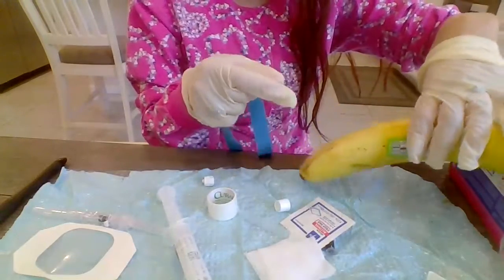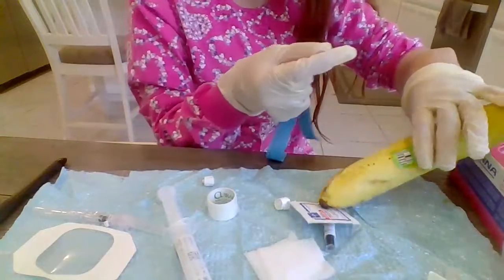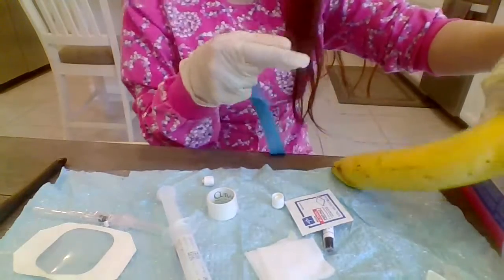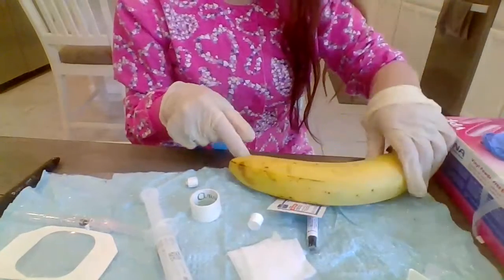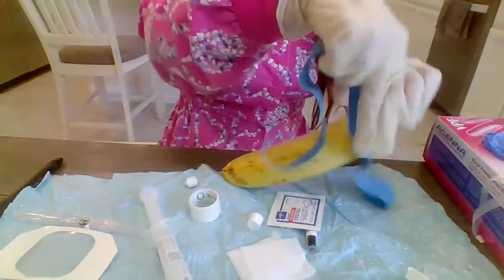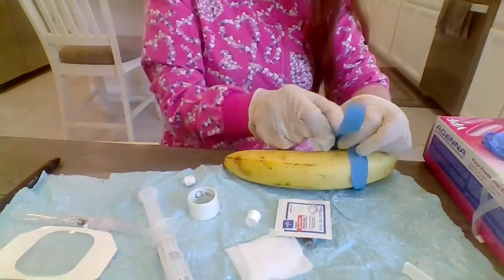As you can see, I am going to go ahead and apply it on about, again, 4 to 6 inches above the IV insertion site.